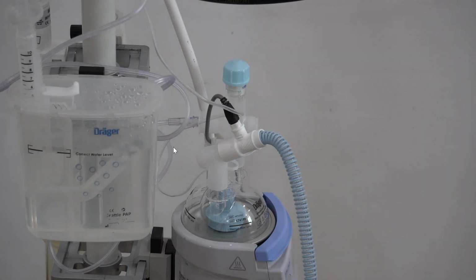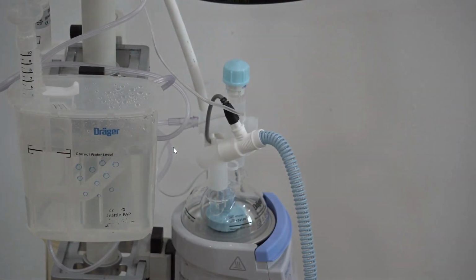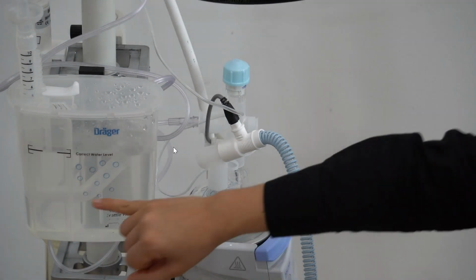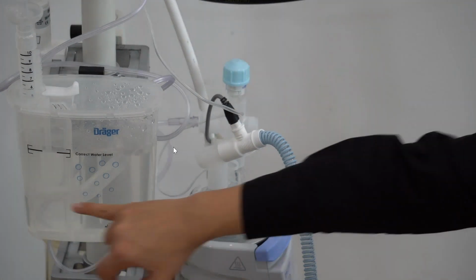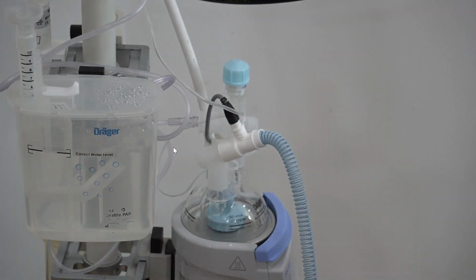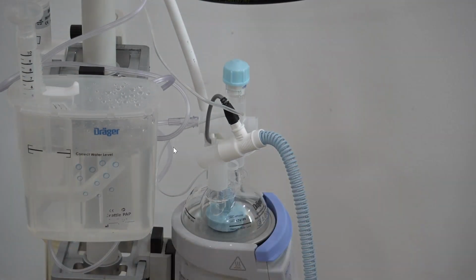In order to ensure appropriate oxygenation, we want to have appropriate delivery of the tidal volume. With this oscillation that the water generates, we produce a certain amount of volume. The research has demonstrated, and that's why it's so important to have the angle at 135 degrees, that the volume generated from this oscillation is higher than the volume generated from the 90-degree tube that we have in some other bubble CPAP systems. That's why we have more effective ventilation, with this more effective oscillation coming from the bubble CPAP.